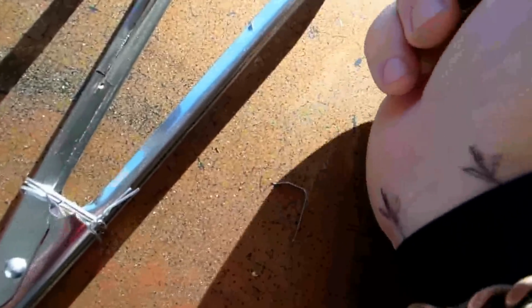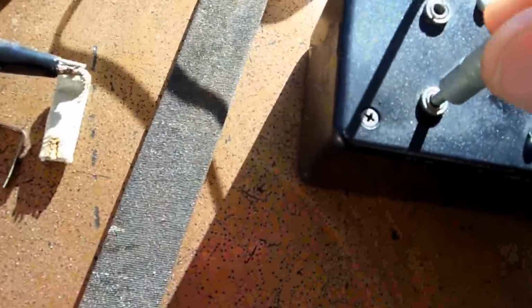So if you look at this strip here, it's no more than 3/16 of an inch wide, so it's like a little less than an eighth inch. It's perfect, and the length is under an inch. See that? Under an inch. So that's right to specification. So basically that goes over the wrist right here, and you put them inside the cloth like that, and you have the wire on there, basically clipped on with an alligator clip, and this plugs into the unit itself right here, and then you pulse right to that.